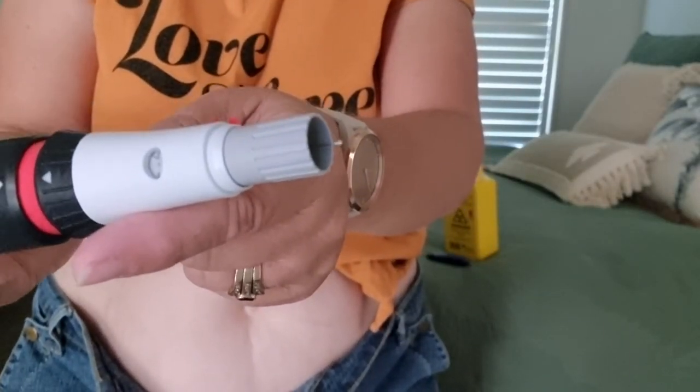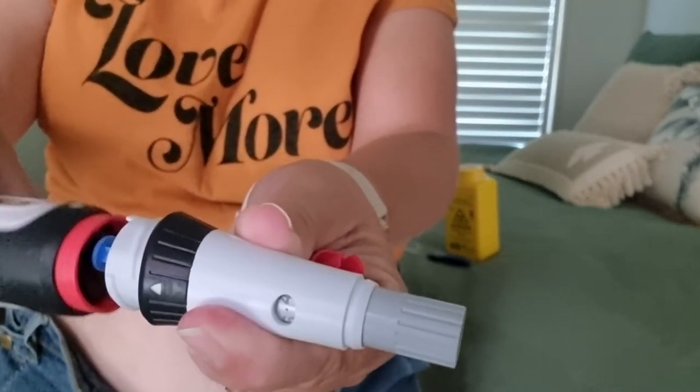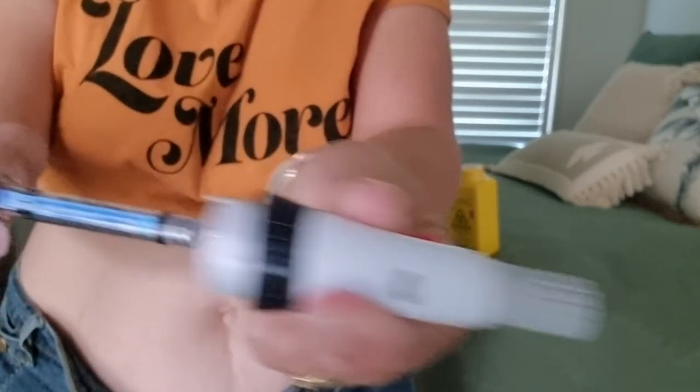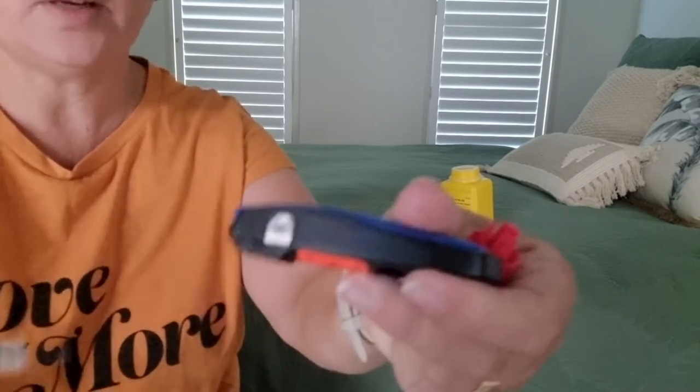Click — you hold for about ten seconds, and you hear that click and it comes back to red. Then the needle is exposed, so be very, very careful here because you don't want a sharp injury. Unscrew it — here's your needle.